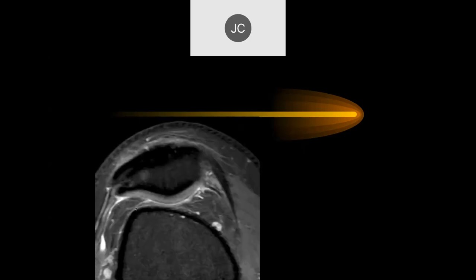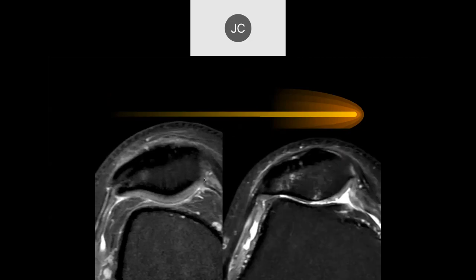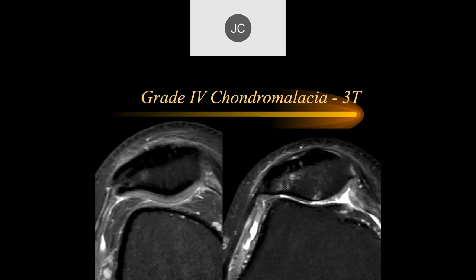On the PD fat sat, we can see nice intact cartilage here in another patient. This is actually another location farther down in this patient, and we can see there's extensive grade 4 when we get to the area of abnormality with subchondral bone edema.